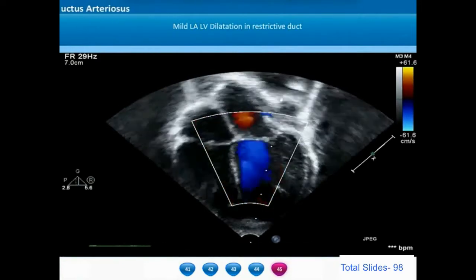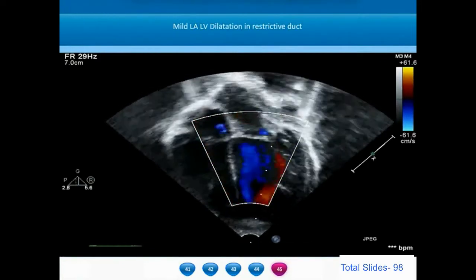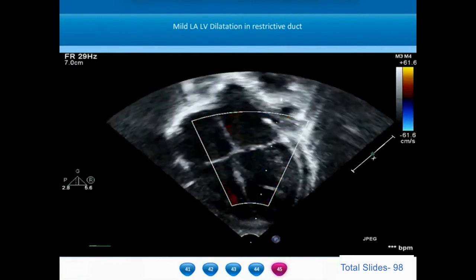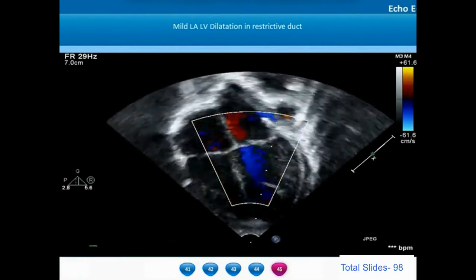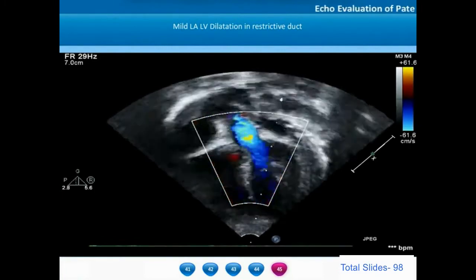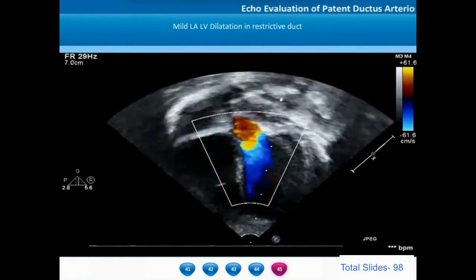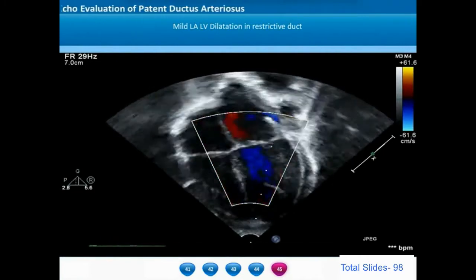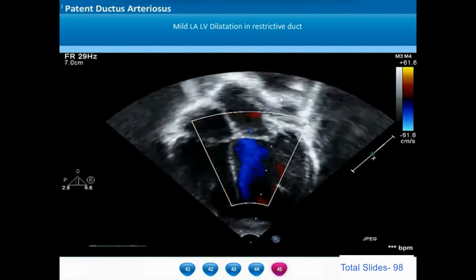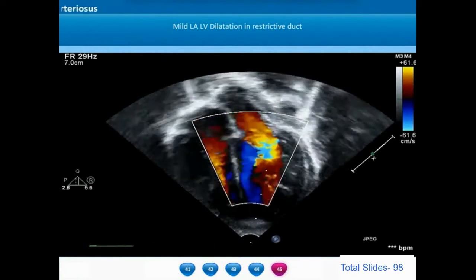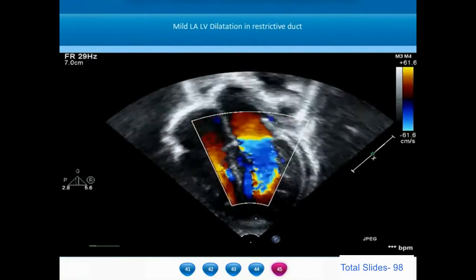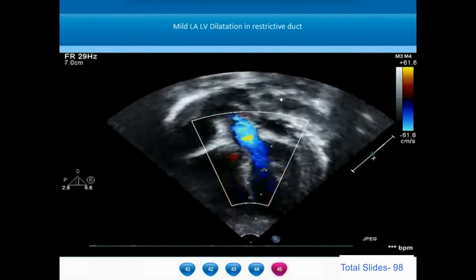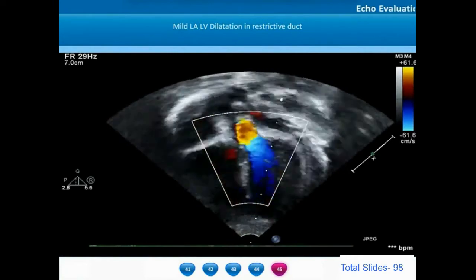In a restrictive small ductus, on the apical four-chamber view, the left atrium and left ventricle will only be very minimally dilated. The dilatation of left atrium and left ventricle in ductus arteriosus is proportionate to the quantum of shunt. A large shunt will cause marked LA and LV dilatation, whereas in a small restrictive PDA there will be very minimal LA-LV dilatation.